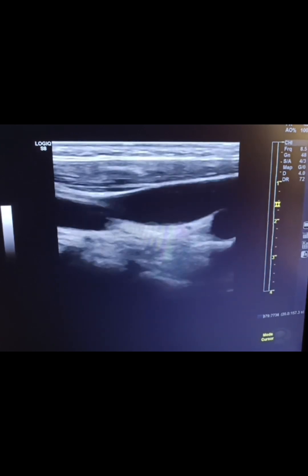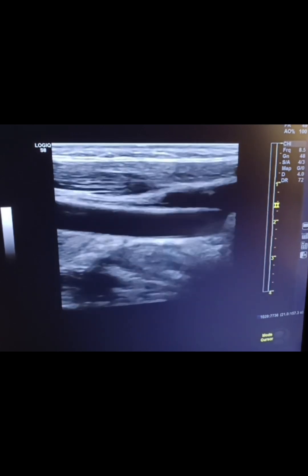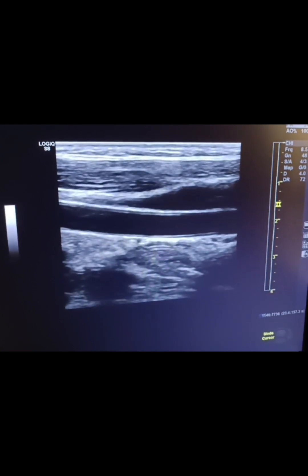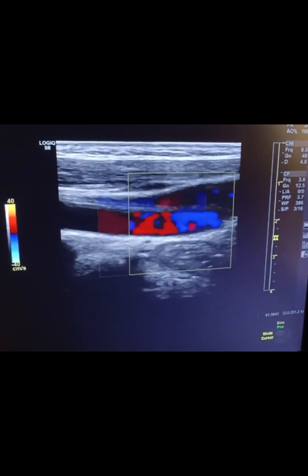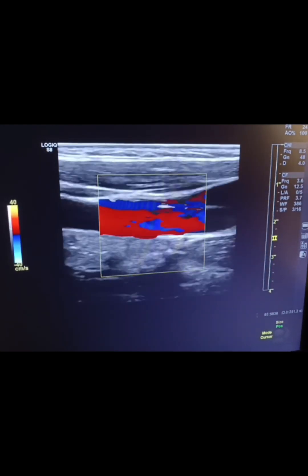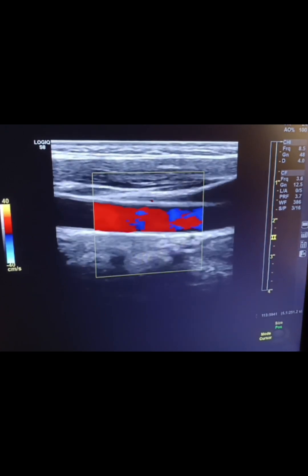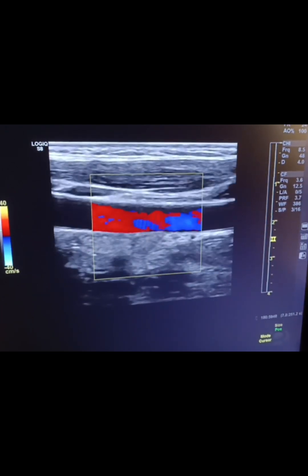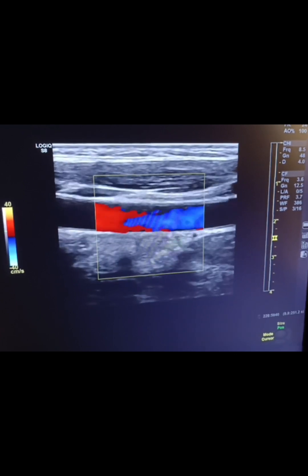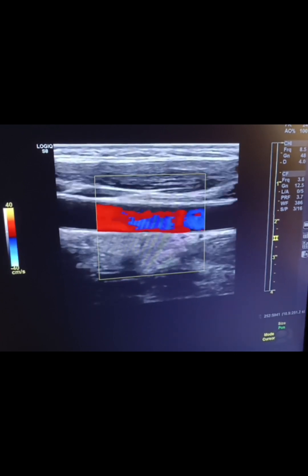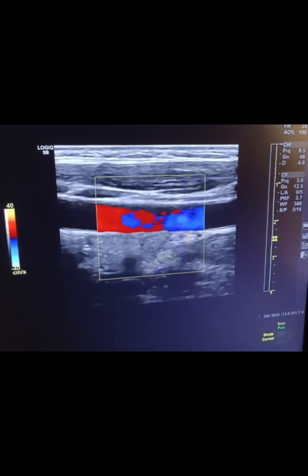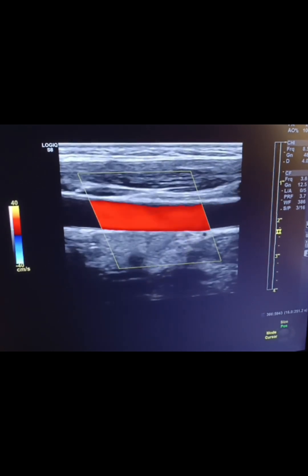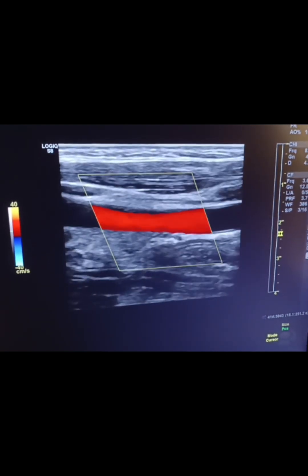I'm just going to look at the CCA here. I'm going to go ahead and put color on this image. One thing you want to understand is when the color box is steered straight down, you can see at that point you're seeing red and blue — that is no Doppler shift. You're not necessarily able to identify the direction of flow.